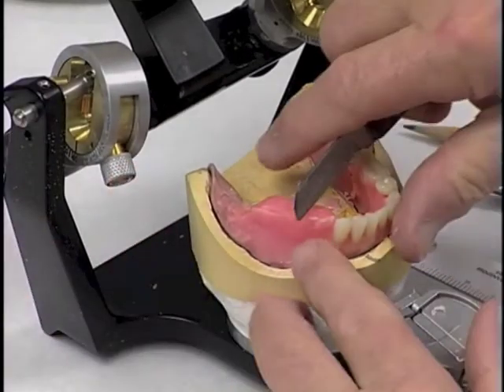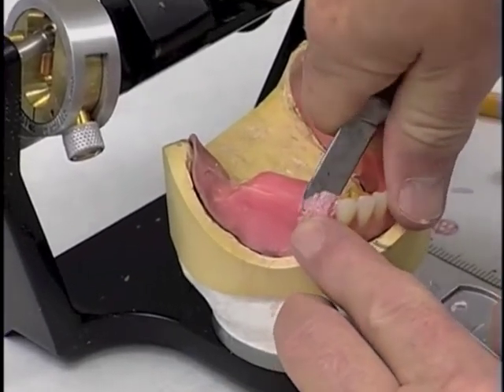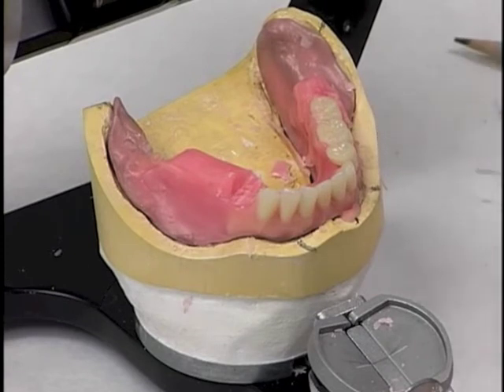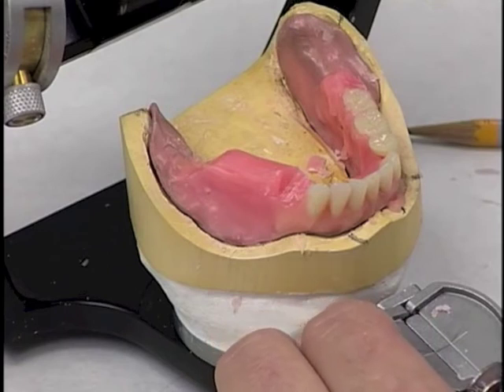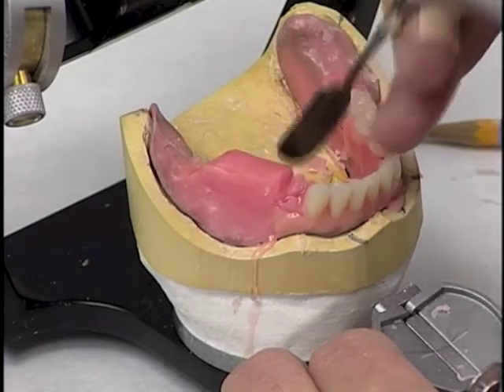Now we're ready to arrange teeth on the opposite side, and we'll start with, again, removing wax in the area of the second premolar where we want to place the second premolar, remembering that we're eliminating first premolars from this arrangement. So again, we'll pull the wax, soften that wax very, very soft in the area where you wish to place the tooth.